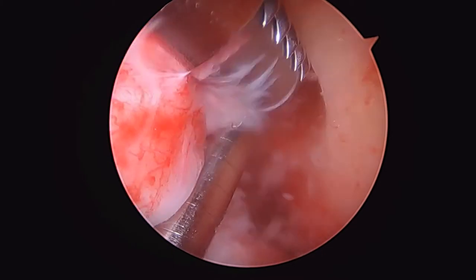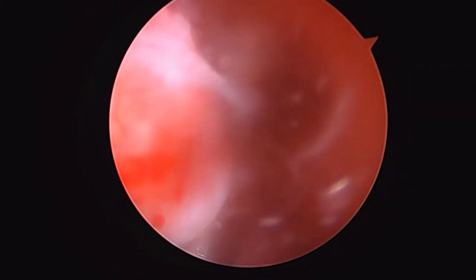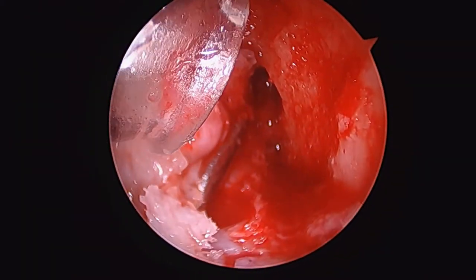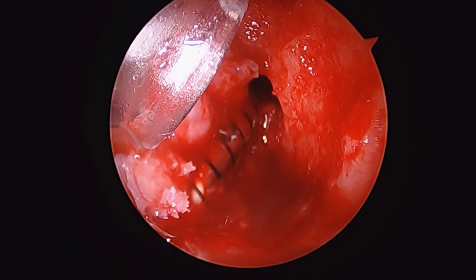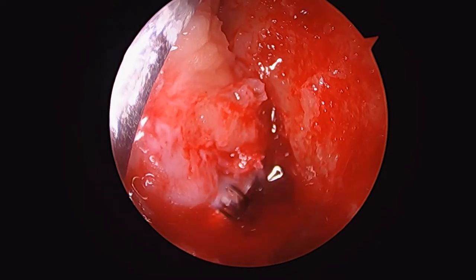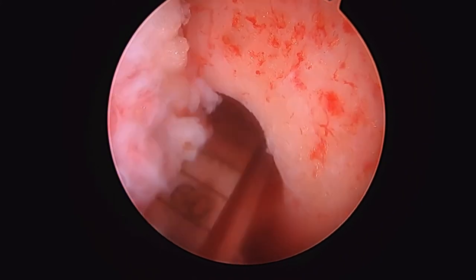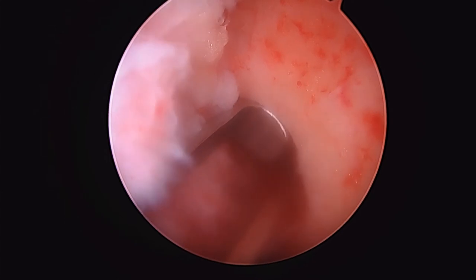We're going to use our endobutton drill. The next drill is a little bit smaller and goes all the way across the femur. Now we're getting ready to take some measurements — the overall tunnel length is right at about 56mm. If we put 25mm of the graft in, our overall graft length is going to be this distance plus 25mm going out to the tibial cortex. We'll go ahead and measure that next.